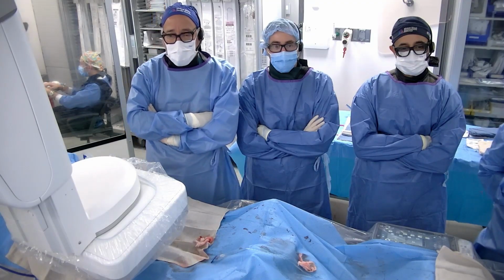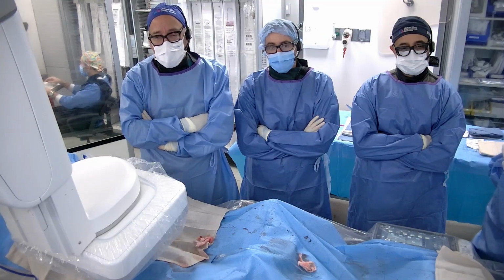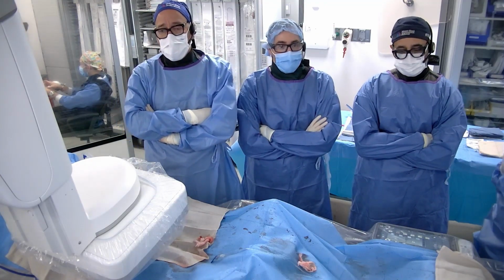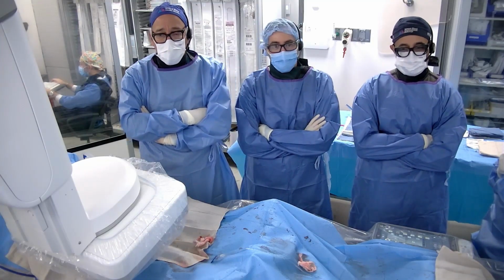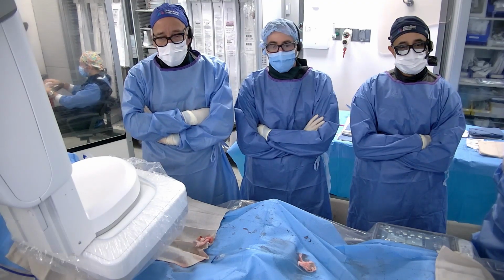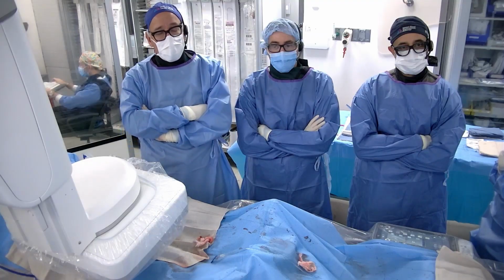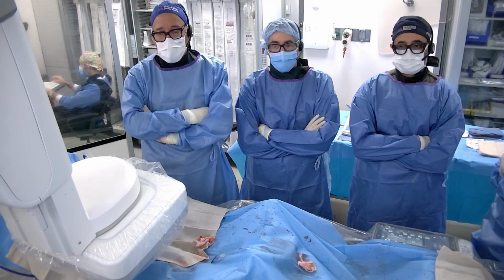If it looks like it's densely calcified and it's a short focal thing, I'm probably going to put in a bioresorbable scaffold. I will say, and maybe it's because, full disclosure, I'm part of the BTK2 trial, I'm a huge fan of IVL below the knee. And to me, that TP trunk lesion did look calcified. I mean, it doesn't necessarily mean you don't need a scaffold, but I would probably aggressively, with the 4 or a 5, IVL that spot after you aspirate.